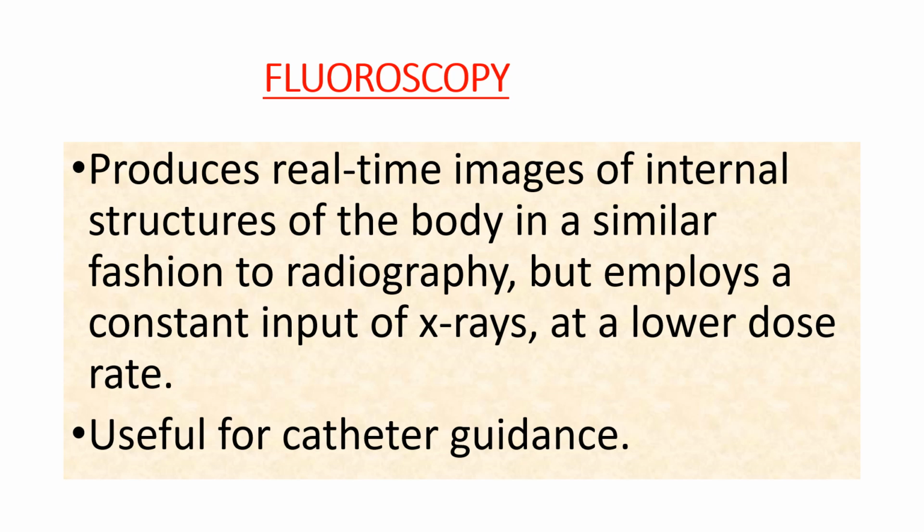Fluoroscopy produces real-time images of internal structures of the body in a similar fashion to radiography, but, note, employs a constant input of X-rays at a lower dose, and is useful for catheter guidance in conducting some procedures.